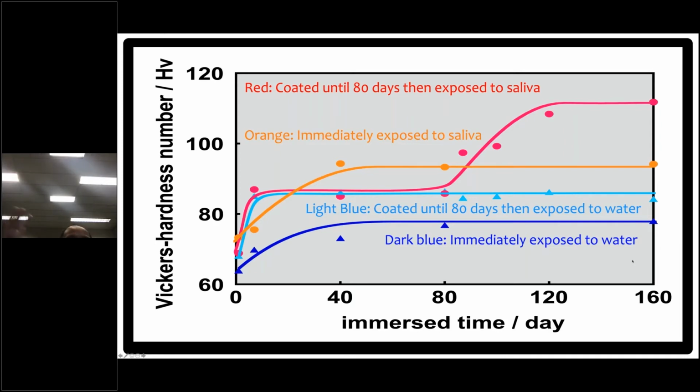So the application of this is this. While you're placing, you have to not freehand build. It has to have a matrix formation to protect it during setting. Right after setting, you don't allow water contamination, you put a coating on it. Once the coating wears off, you don't have to do anything. It will wear off by itself in the mouth.